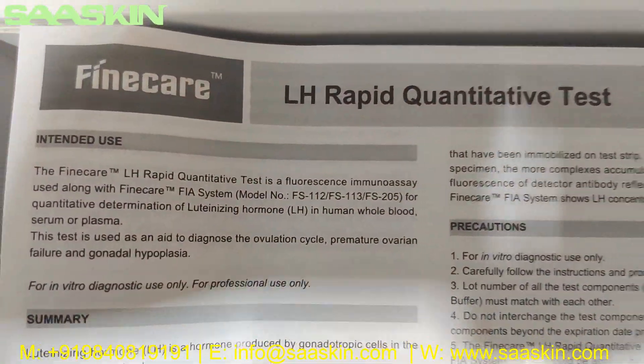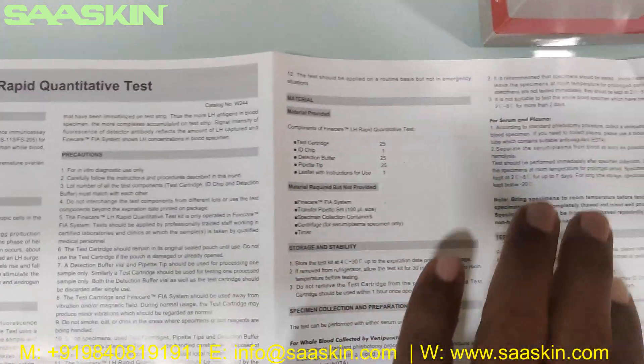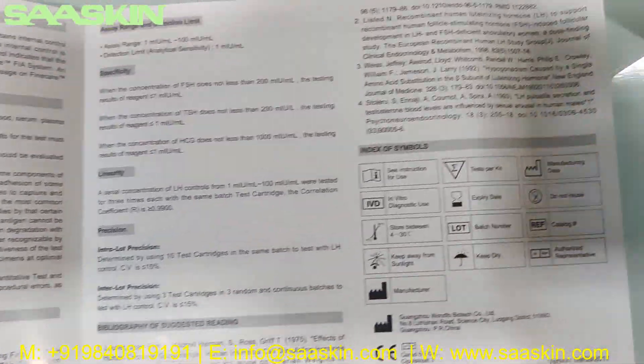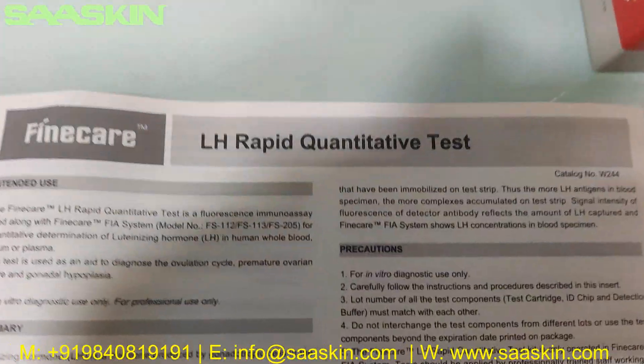Inside you can see there is a leaflet for instructions for use. It is a complete, detailed leaflet that has all the contents and information for you to complete the total test procedures — how to prepare the test, how to conduct the test, and how to interpret the results. It gives you all the complete details and guidance.